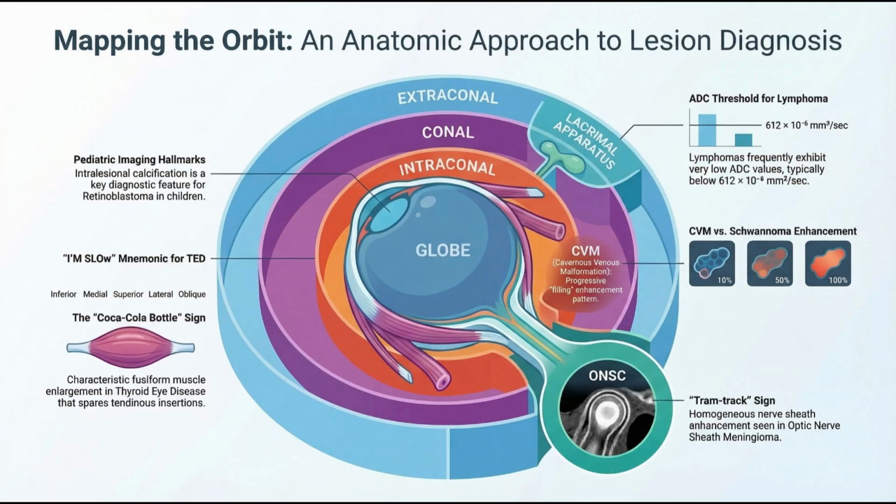Absolutely not. It is a highly structured, intricately zoned map. Radiologists aren't just looking for ambiguous gray blobs on a screen. They're essentially highly trained cartographers. They are reading the borders, identifying the shapes, and watching the fluid dynamics in the ballroom to diagnose exactly what the problem is, simply by knowing where the problem lives.